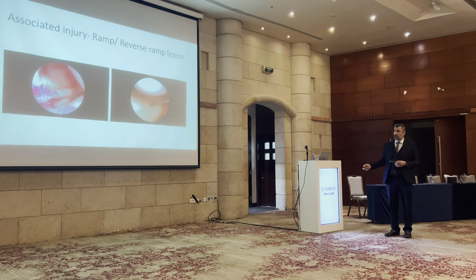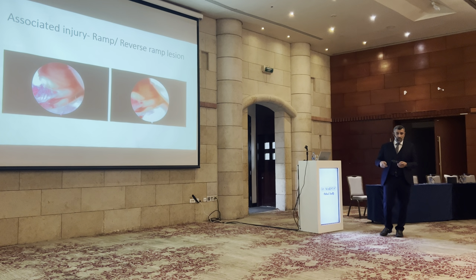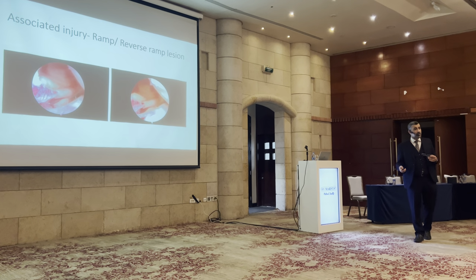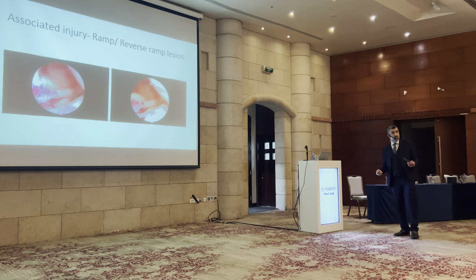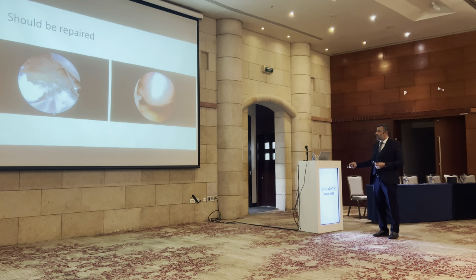Associated injuries, the most important being ramp and reverse ramp lesions. And this is a case where we did ACL and there was a reverse ramp. Always when you do ACL, you go to the posterior knee to see if there is a ramp or reverse ramp. It's more common than you believe. It may reach up to 20-21%. One in five cases, one in each five. So you have to take care.